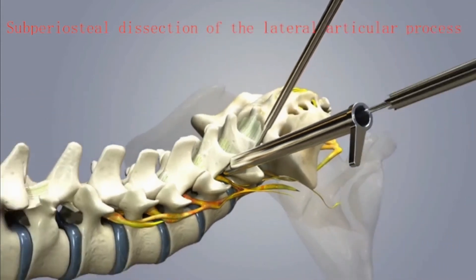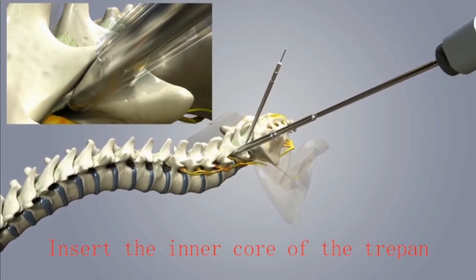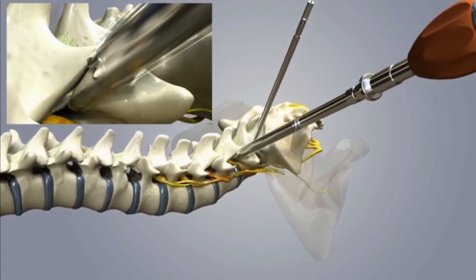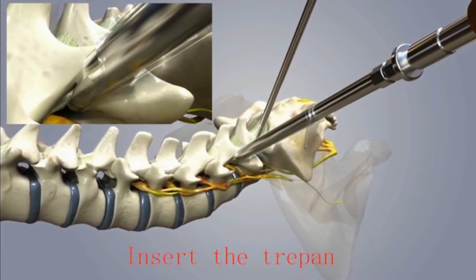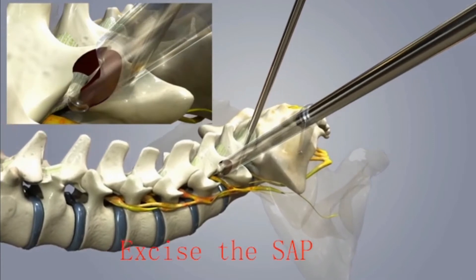Subperiosteal dissection of the lateral superior articular process was done and the inner core of the trephine was inserted and fixed. Then the majority of the superior articular process was excised and taken out by the trephine, and the intervertebral foramen was enlarged.